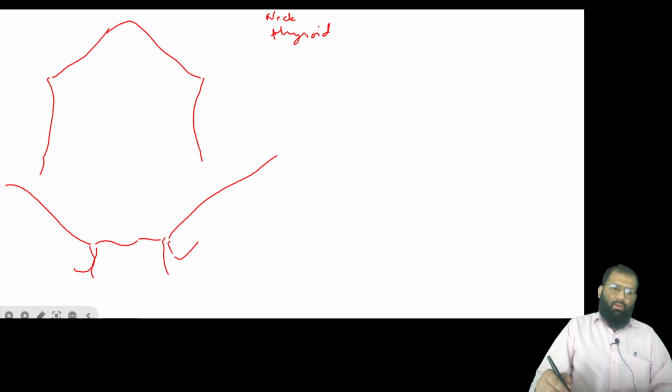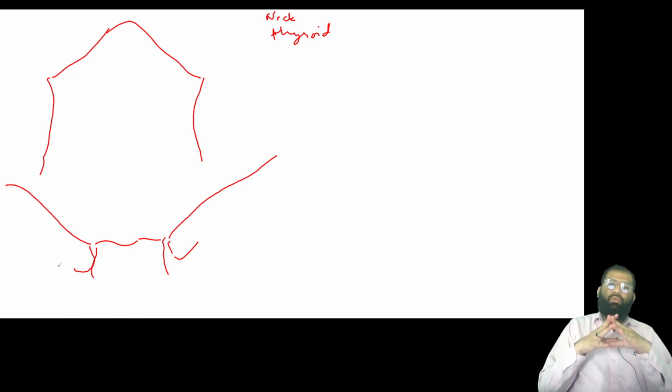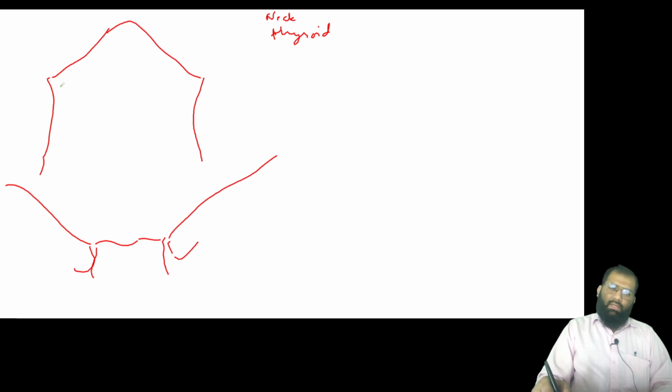Okay. Now, as a normal important thing, I want you all to see my session on introduction of thyroid, in which I've talked about the entire details on when do you do neck ultrasound, and when do you go for thyroid ultrasound. There are lots of indications, just few to enumerate: any thyroid swelling, midline swelling, thyroglossal cyst, in case of thyroiditis, in case you suspect thyroid malignancies, thyroid nodule, whether to characterize it as malignant or benign. So all these are important conditions where you look for thyroid ultrasound.